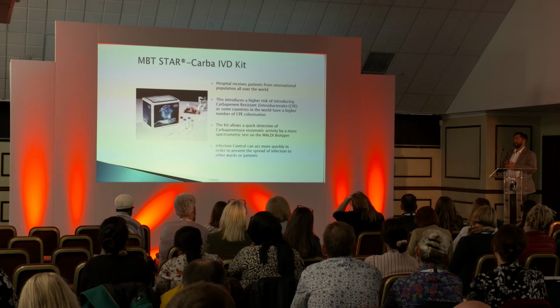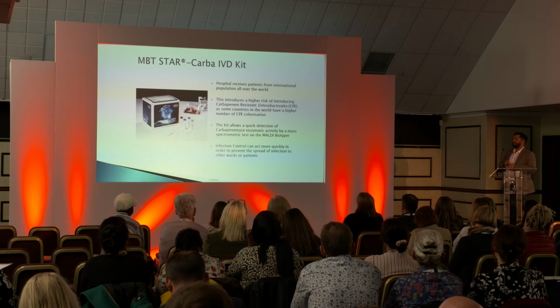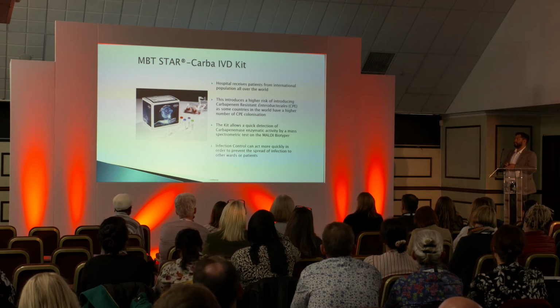So I guess the key things about transmission. The kit allows a quick detection of carbapenemase by enzymatic activity by a mass spectrometry test on the Malditof.